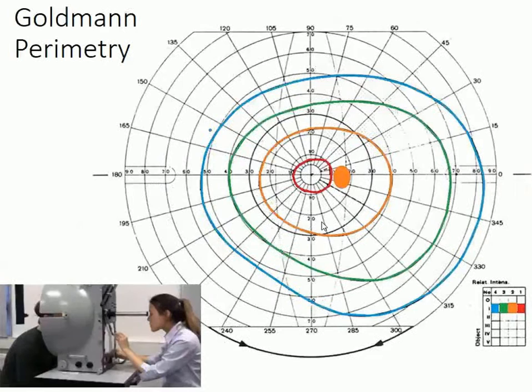So again, originally this was the gold standard for many years of testing someone's visual field. But it was very time dependent and technician dependent, and there was an effort to find a more efficient way of testing. And experts seem to pay attention to the fact that for most diseases, in order to pick them up, you didn't need to test the whole visual field, and that if you focused on the central area within 30 degrees, your sensitivity was still very, very good to pick up diseases.